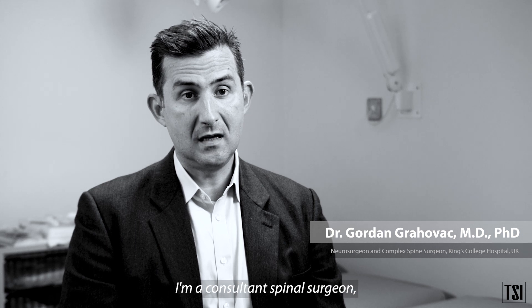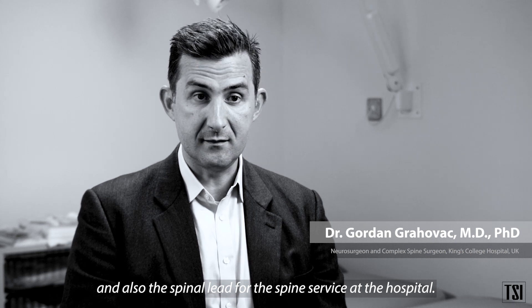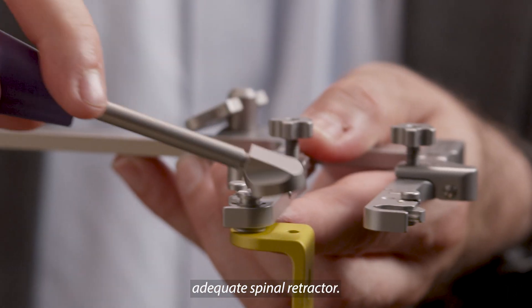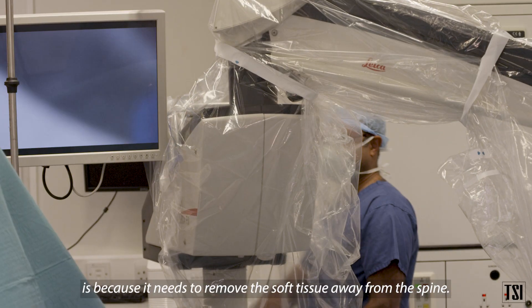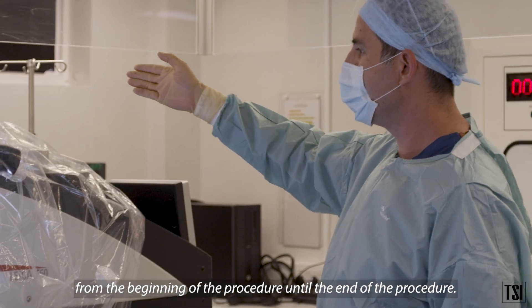My name is Gordon Grahovać. I'm a consultant spinal surgeon who works at King's College Hospital in London and I'm also the spinal lead for the spinal service at the hospital. Spinal surgery cannot be done without an adequate spinal retractor. You need a good retractor because it needs to remove the soft tissue away from the spine, and it follows you from the beginning of the procedure till the end.